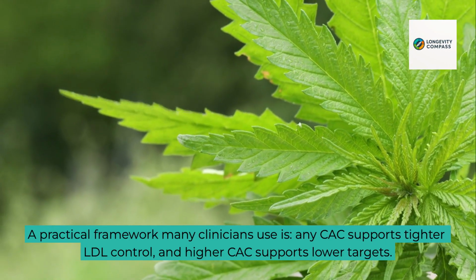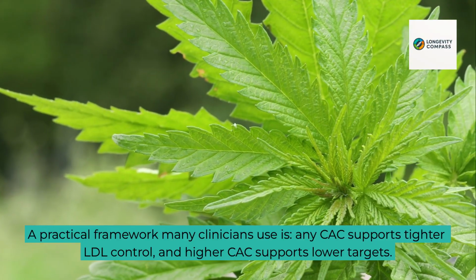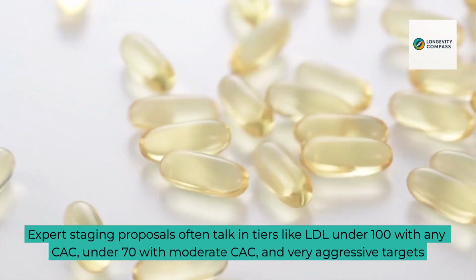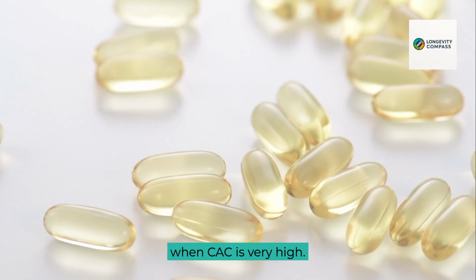A practical framework many clinicians use is, any CAC supports tighter LDL control, and higher CAC supports lower targets. Expert staging proposals often talk in tiers like LDL under 100 with any CAC, under 70 with moderate CAC, and very aggressive targets when CAC is very high.